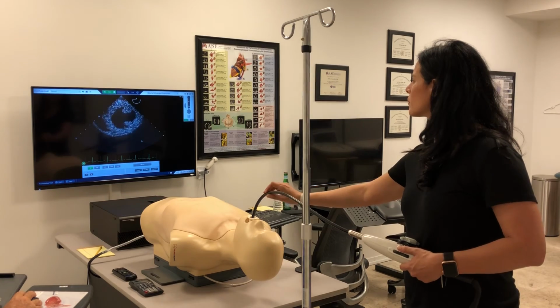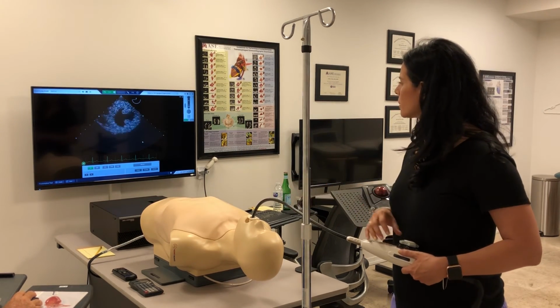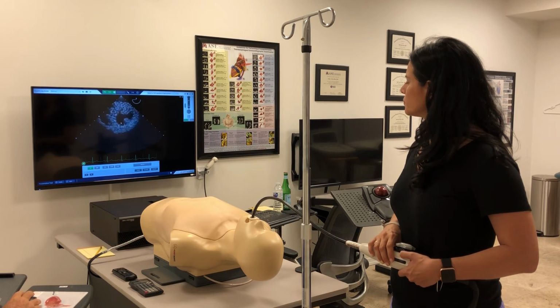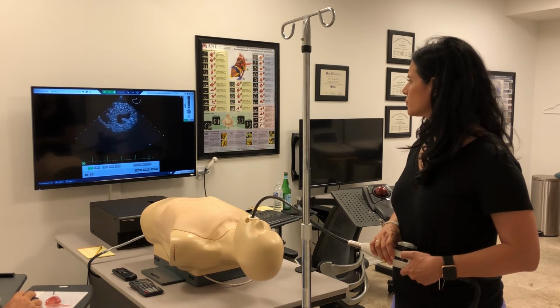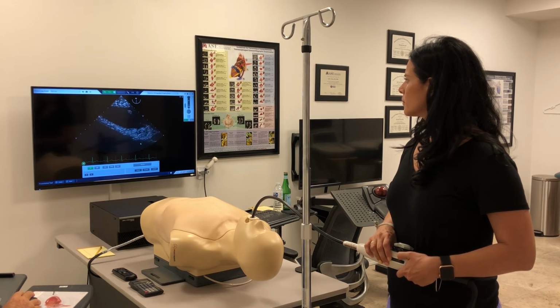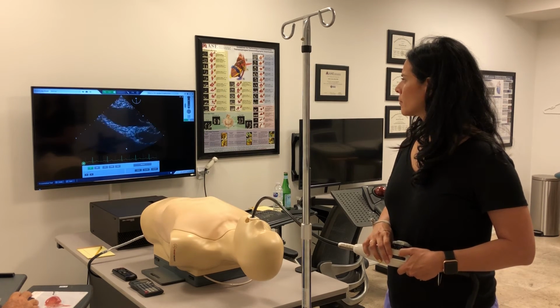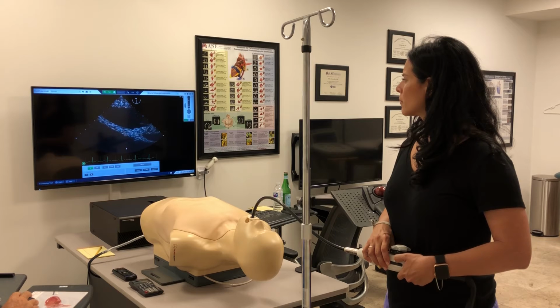So back down to the papillary muscles. Good. Now, we're going to get the two-chamber view, which is simply this view with the LV well-centered and with an omniplane of 90 degrees. So this is a short-axis view. We're going to look at the two-chamber view, which is the long axis of the left ventricle. So we go to 90 degrees. We go from 0 to 90 degrees.